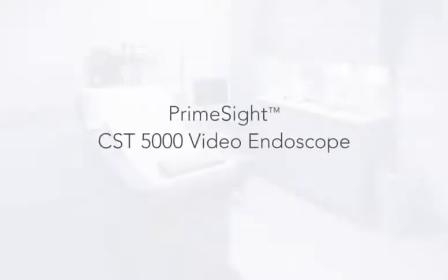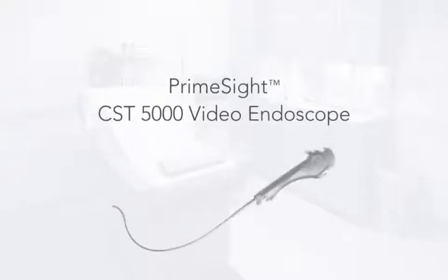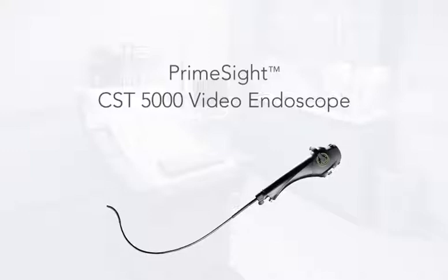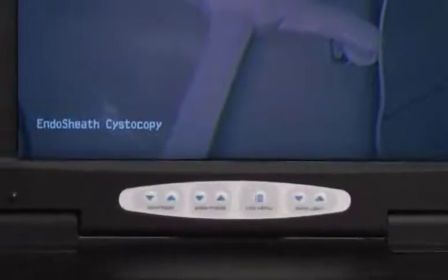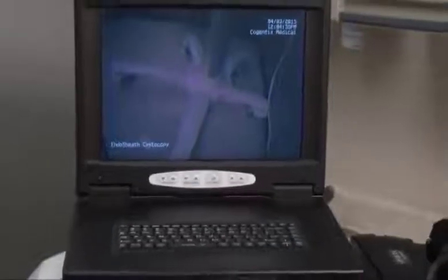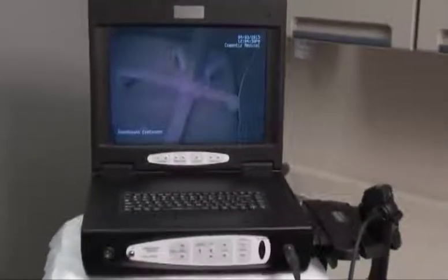The CST 5000 Flexible Cystoscopy System introduces a powerful and efficient solution for urologists in both their hospitals and private clinic settings, with reliable capabilities and complete functionality for performing traditional cystoscopy procedures and surgeries. The system is designed to help physicians perform safe and effective procedures while providing breakthrough advances that could significantly improve the efficiency of the urology practice.